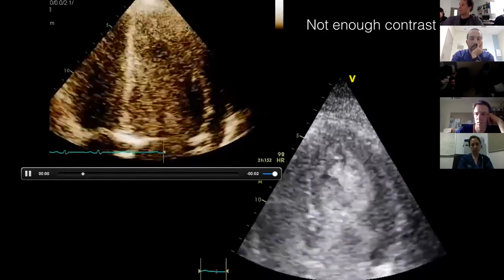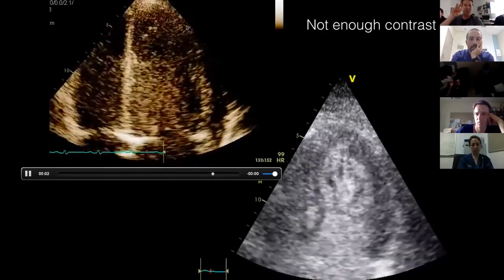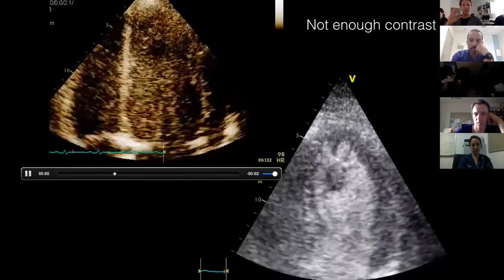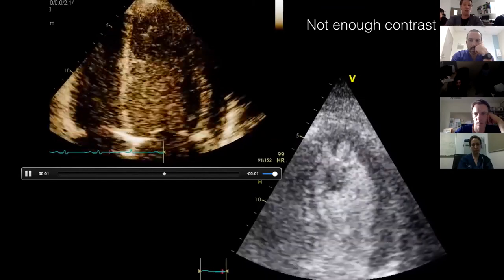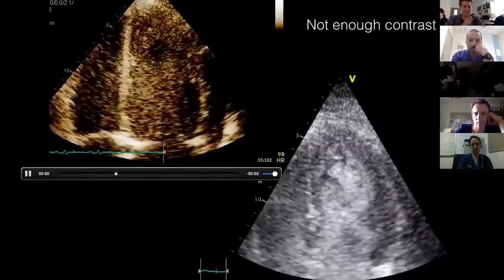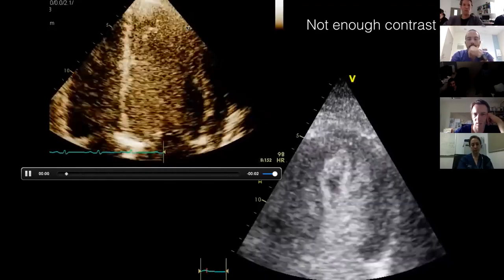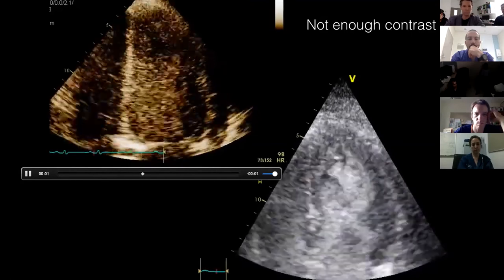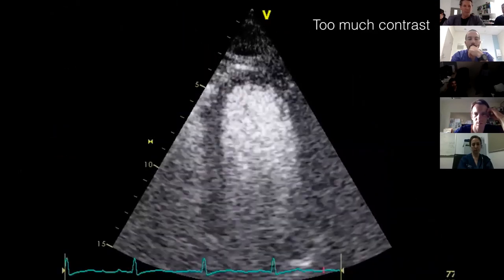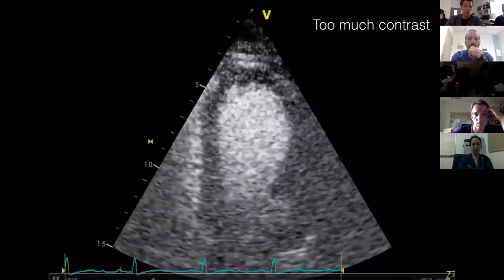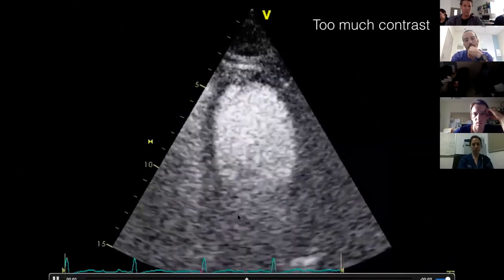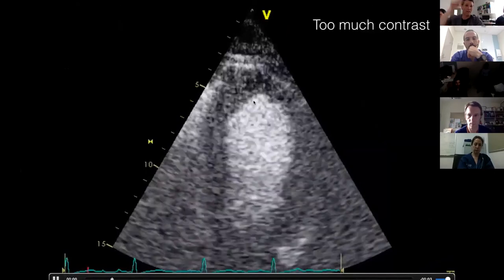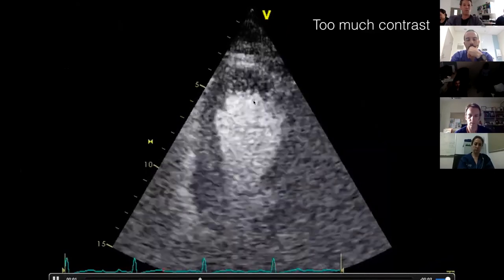Another source of false positives: if you've waited too long since the last bolus, or haven't given enough contrast, you can get an apparent filling defect simply because there aren't enough bubbles around — even with correct settings. Conversely, giving too much contrast can cause acoustic shadowing at the back wall, which could be mistaken for a filling defect because the bright signal up front prevents sound from reaching the posterior wall at low mechanical index.